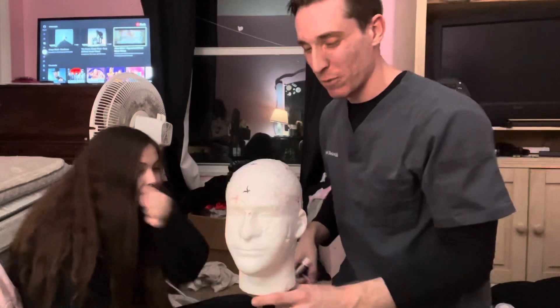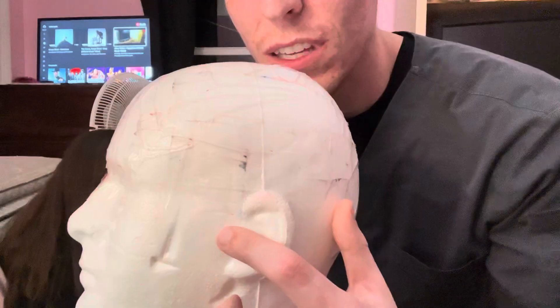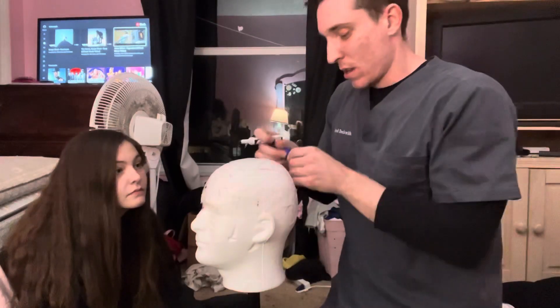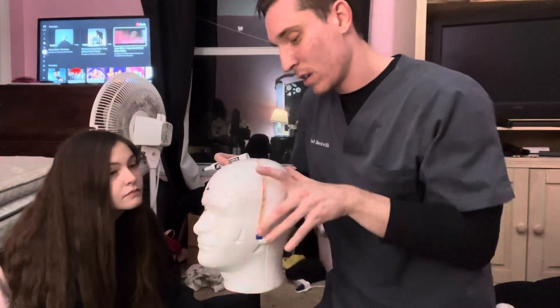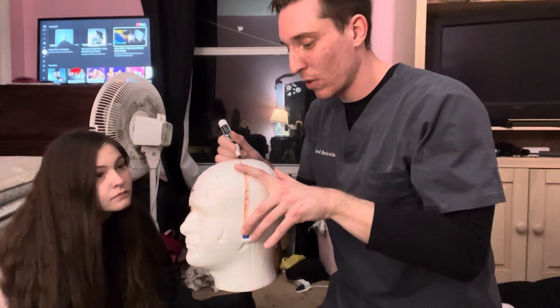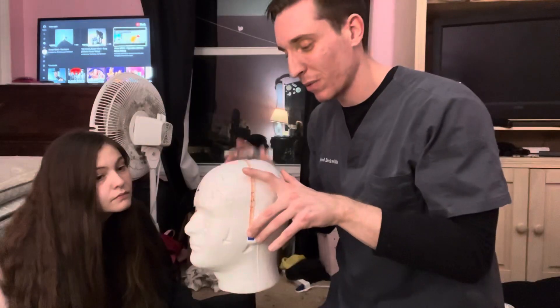So that's front to back. Once you do front to back, now you have to do side to side. When you start side to side, you're going to want to start at your pre-auricular points, which is right here next to the ear. So pretty much from ear to ear you're going to want to measure. You're going to be going through the CZ mark you made in the middle of the head and crossing it. Going from ear to ear, it's about 34 centimeters as well. We cross our CZ mark in the middle, which proves this is the middle of the head.